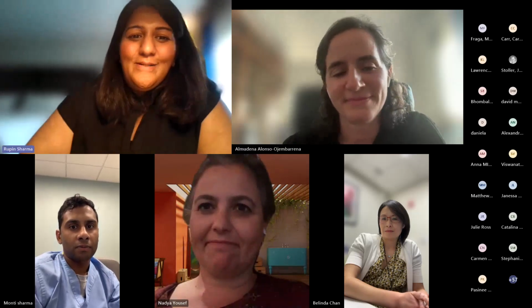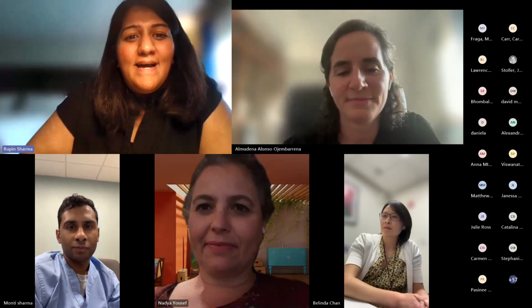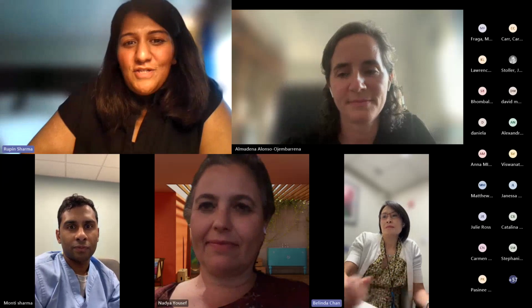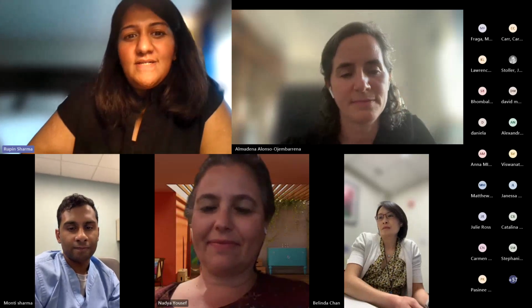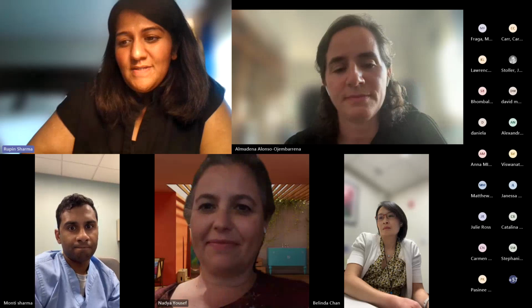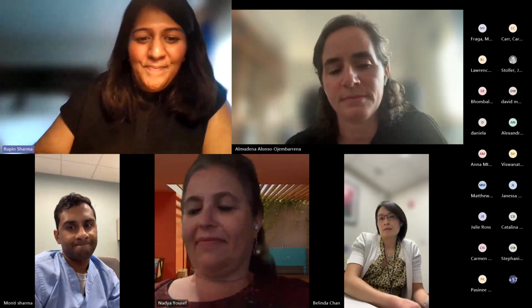Thank you so much. And I guess we can take a couple more questions. Our next question is, has identifying patients at risk for BPD by lung ultrasound led to different management strategies and earlier use of interventions such as steroids, diuretics, or PDA management?